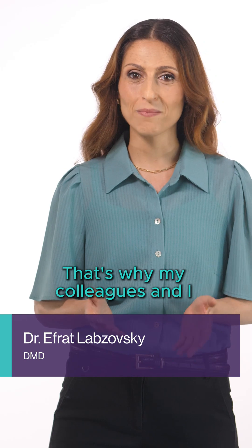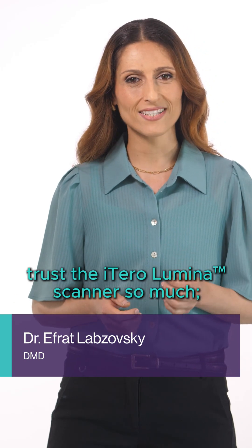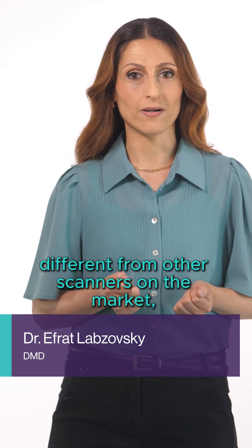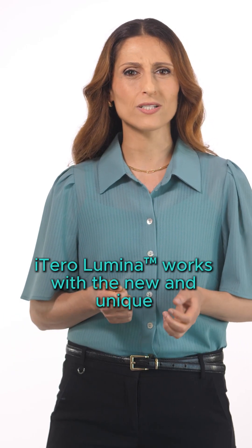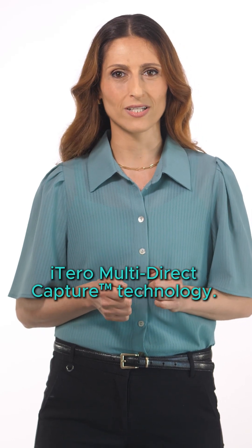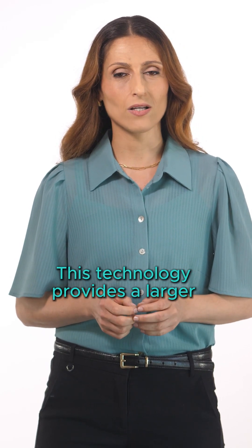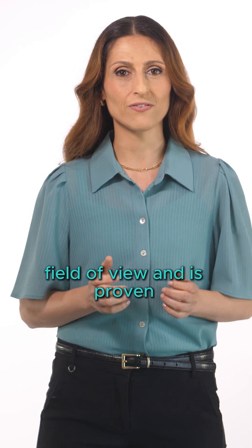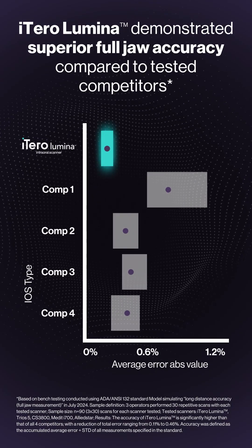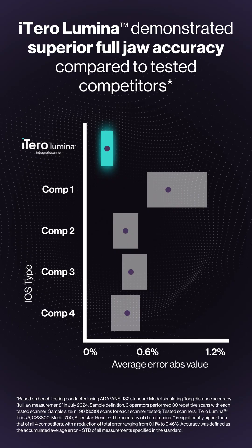That's why my colleagues and I trust the iTero Lumina scanner so much. Different from other scanners on the market, iTero Lumina works with the new and unique iTero Multidirect Capture Technology. This technology provides a larger field of view and is proven to deliver superior clinical accuracy compared to tested competitors.